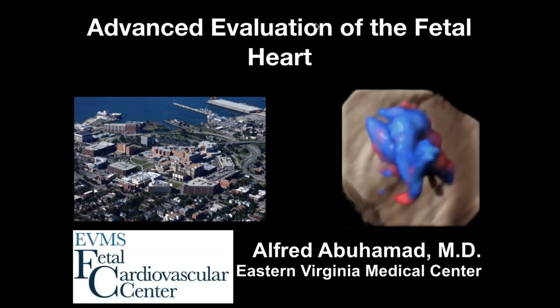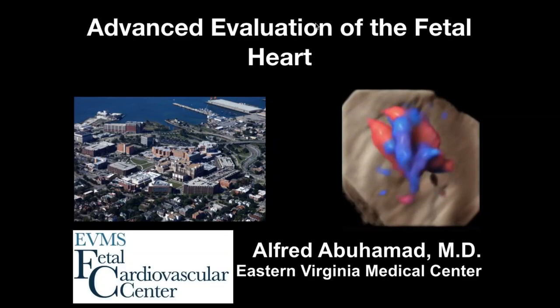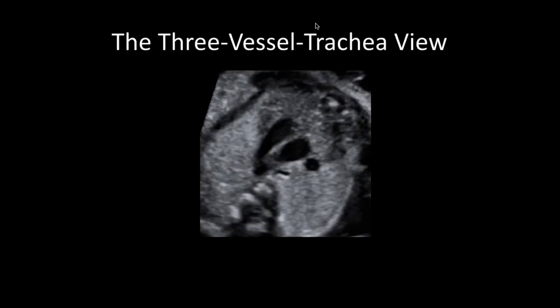I would like to thank Kathy Minton for organizing the webinar and the AIUM for asking me to speak to you today. I'm going to talk about advanced evaluation of the fetal heart, and primarily I'm going to focus today on the role of the three-vessel trachea view in the evaluation of the normal and abnormal cardiac anatomy. As Kathy had stated, I have no disclosures relevant to this presentation.